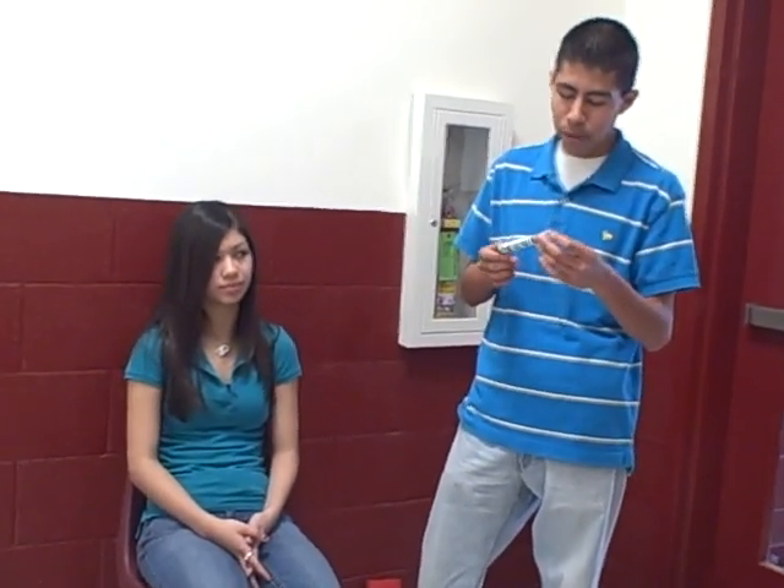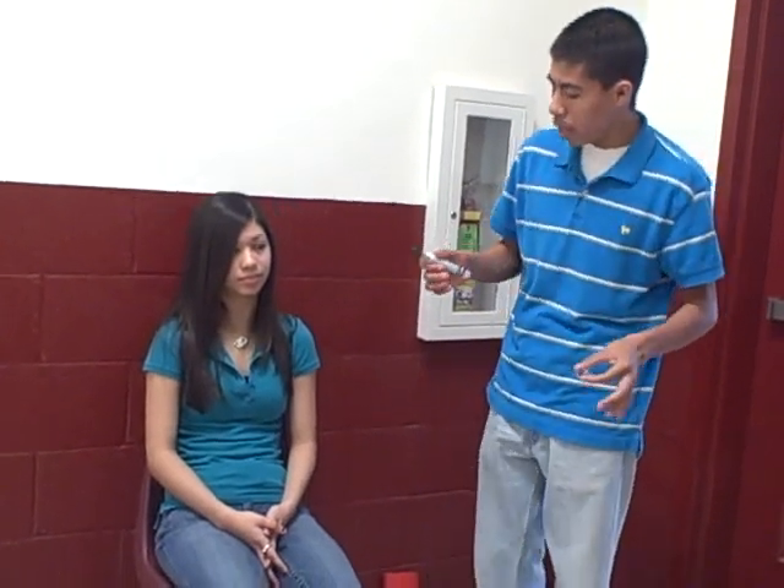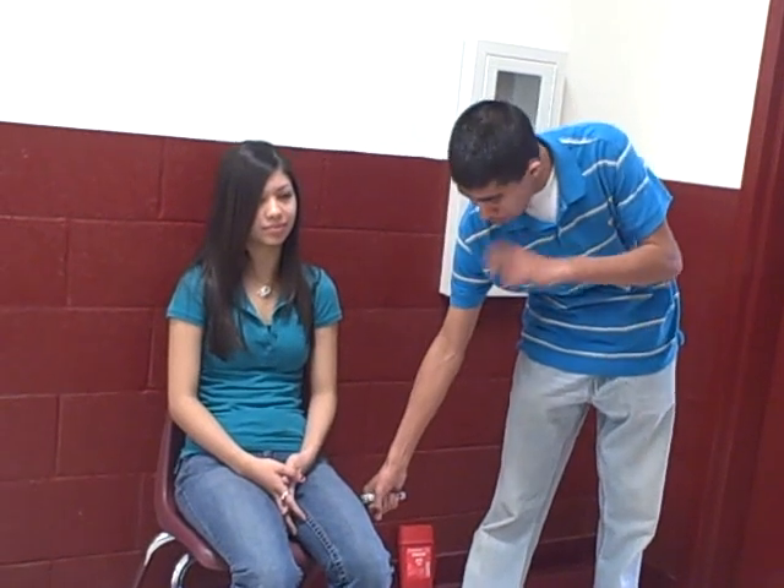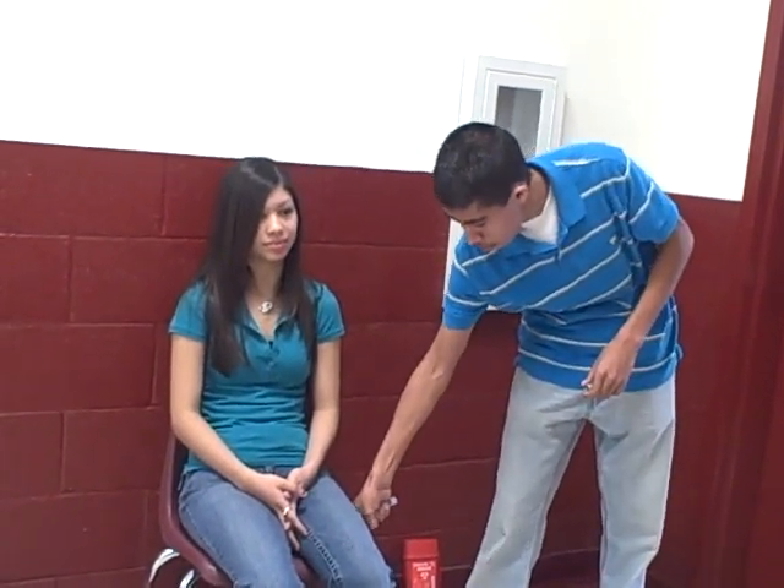I'm going to check my medication again — my dose. I'm removing my safety cap. I hold the EpiPen against the side and push it in.